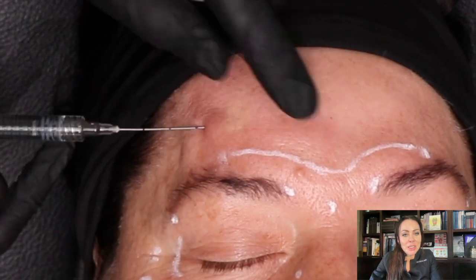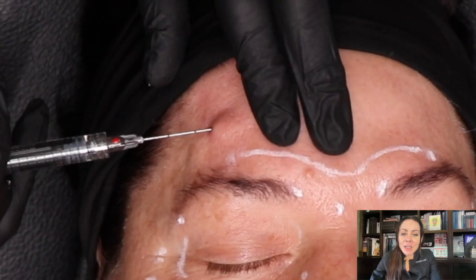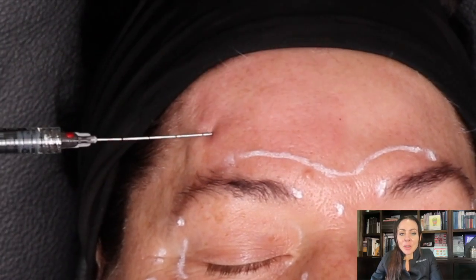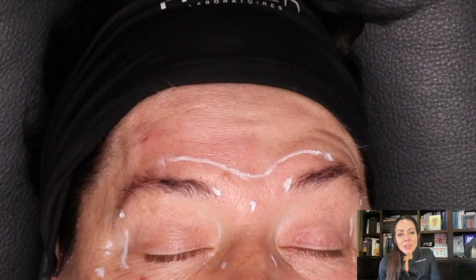It's very important that we use a low viscosity HA filler, and at all times be very cautious for any vascular accident. Check the capillary refill, look for blanching, and watch for any signs of sudden pain or sudden sensations. Patients may feel a tingling from nerves being touched, but any other pain, marble effect, or blanching effect should raise immediate concern.